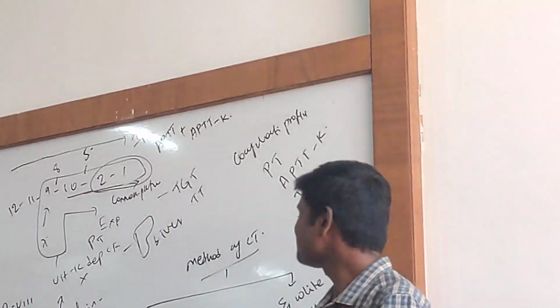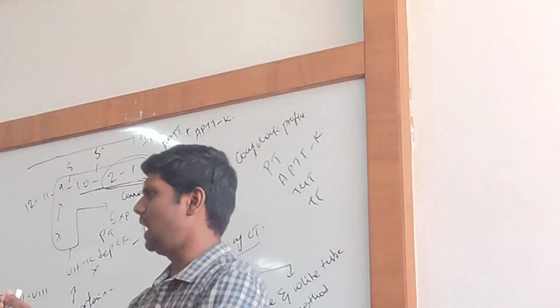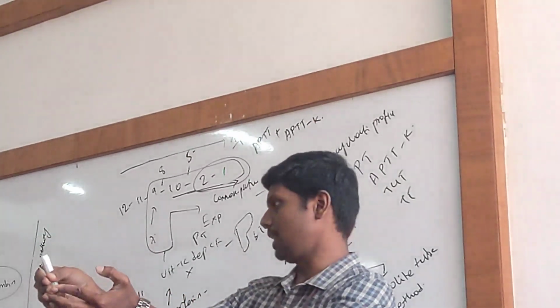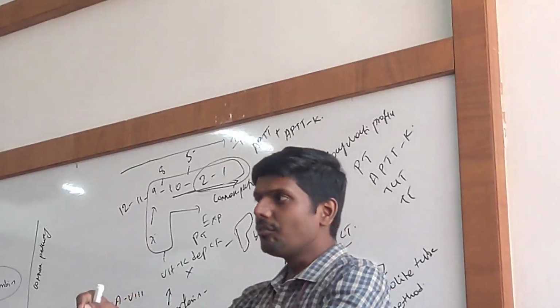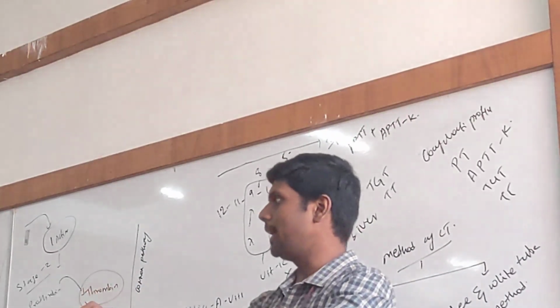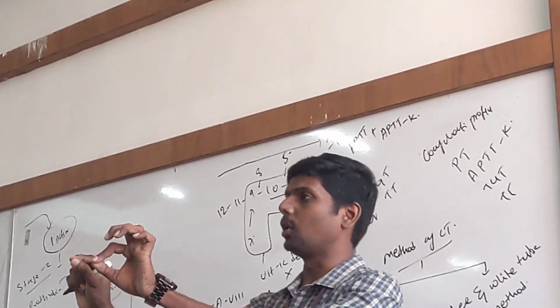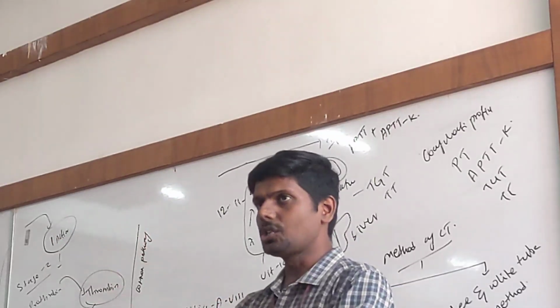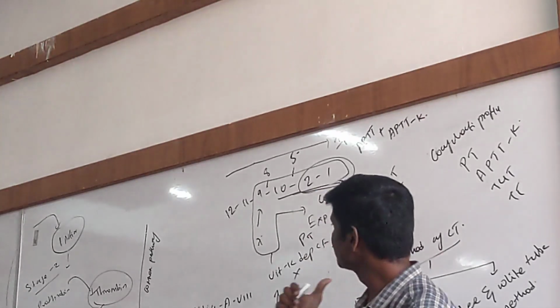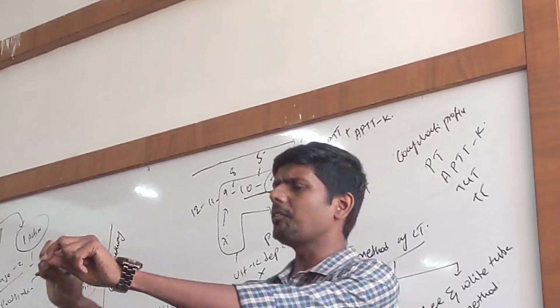Anyway, that is the capillary tube test. The actual test procedure is like this. Finger prick, start the stopwatch, charge the capillary tube and fill it. Every 30 seconds, you need to break the tube. At one particular point, the blood will clot. You will see a fibrin thread in between the two broken pieces. Once you see the fibrin thread, stop the stopwatch, and that will be your capillary clotting time.